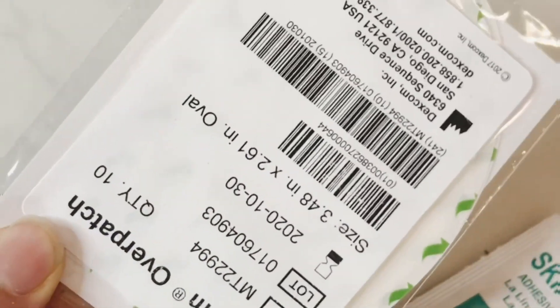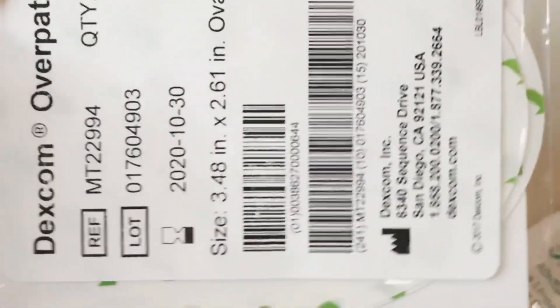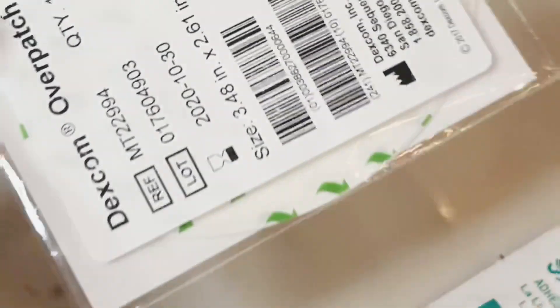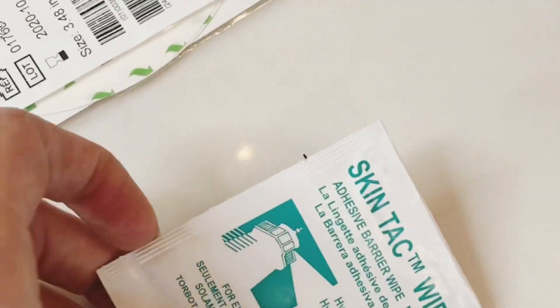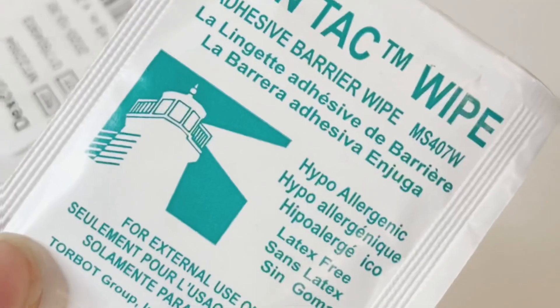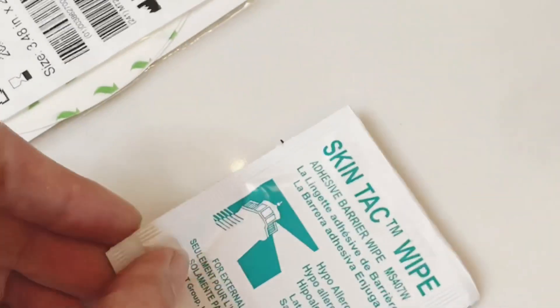If you don't have overpatches, you can actually call Dexcom and they will send these to you. They're happy to send these because when you're using an overpatch, you have a much decreased chance of your sensor falling off. Skintac — you can get about 50 of them for about 12 bucks on Amazon.